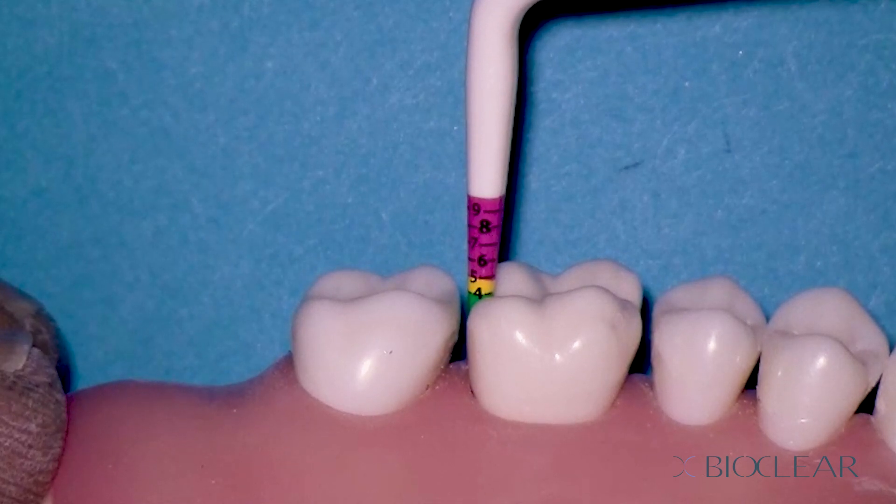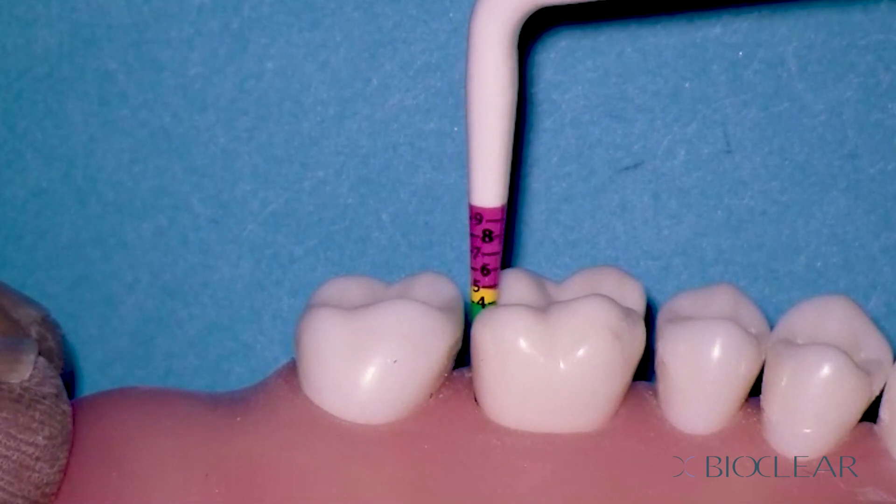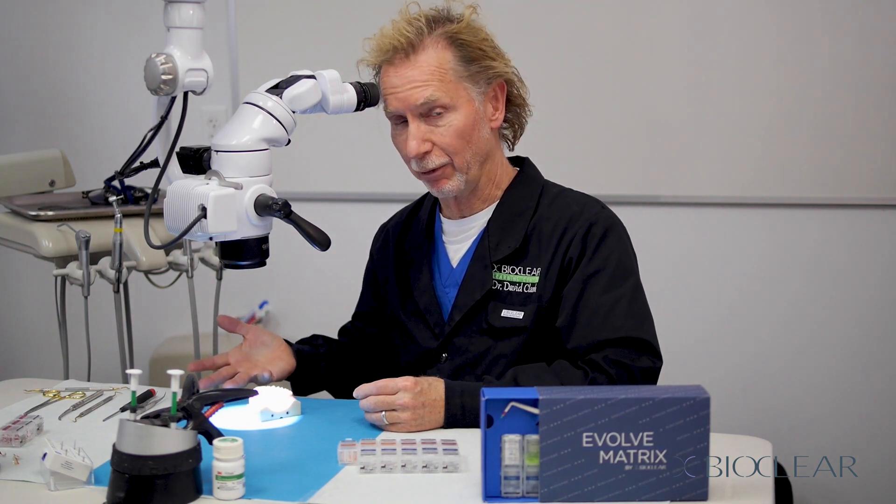To select the height of the matrix, once you've measured the cavity preparation, look at your references. We want the matrix to go past the edge of the prep by at least a millimeter or two to get a great seal. In a young patient, it's going to be four plus one — so if the cavity is four millimeters deep, we add one millimeter and pick a five millimeter matrix. For most adult patients, it's four plus two equals six. So if this is an adult patient and the cavity prep measures four, we grab a six millimeter matrix.